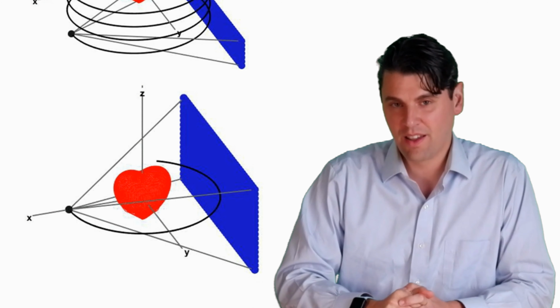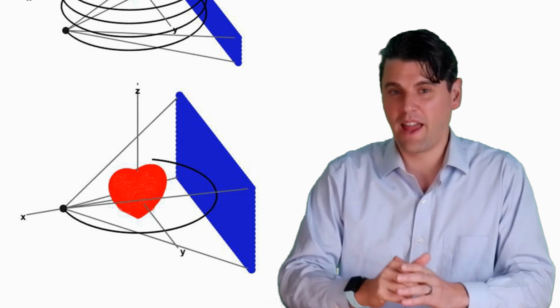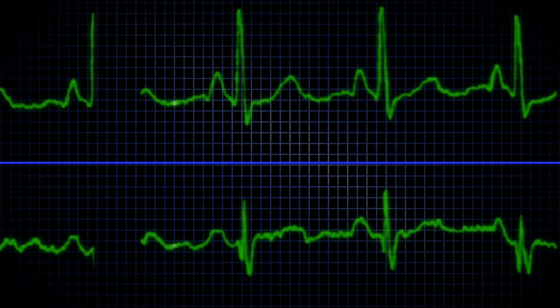And for imaging the heart, when you want to cover the whole heart in just one acquisition, if your heart rate is relatively reliable, you can use a higher pitch scanning mode on a two-tube, two-detector system, or optimally, you can use a wide coverage system where in just one acquisition, you can cover the complete heart. On this system, it also allows you to do gated reconstruction and to change the phase of your reconstruction, because each image that you make of the heart, the entire heart is at the same phase because we were able to acquire the heart and make the images of the heart all consistently at the same phase.